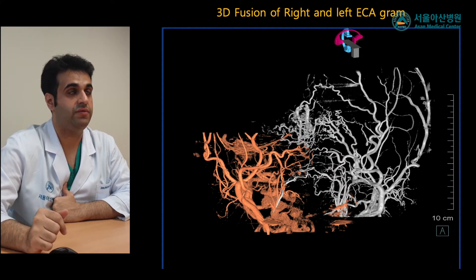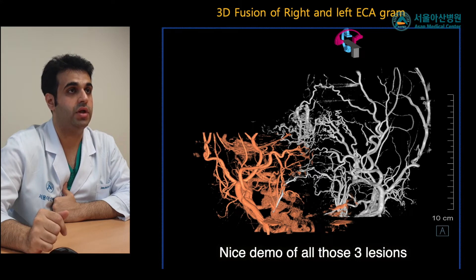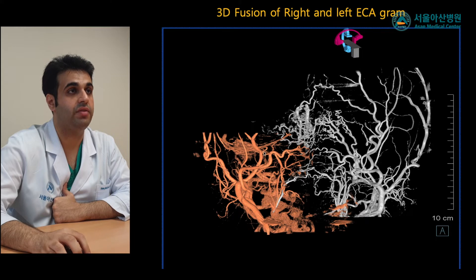The 3D fusion of the right and left external carotid artery angiograms demonstrated three locations of the fistula: the lateral sinus, the posterior condylar vein, and the torcular dural AV fistula.